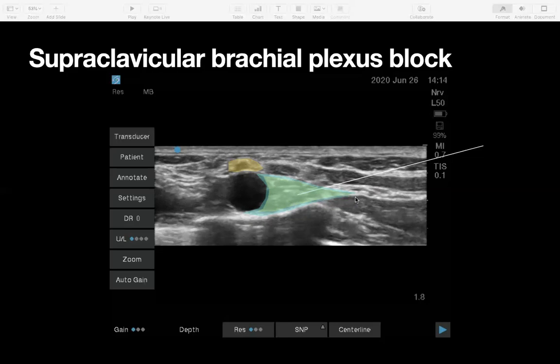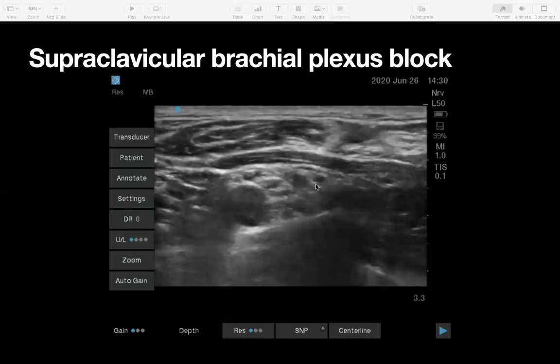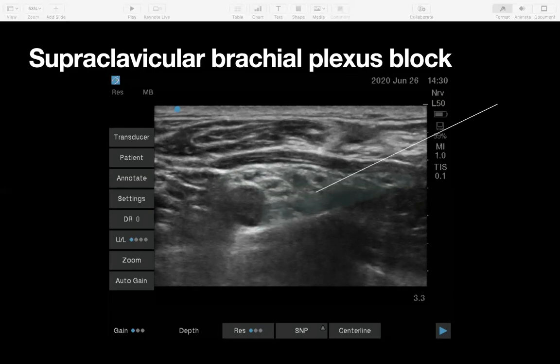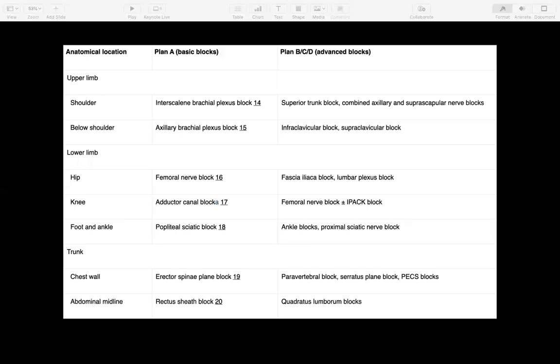Always hydrodissect as you go, ensuring you're never advancing your needle onto nerve tissue itself. You might need to re-angle the needle to get local spreading all the way up. Sometimes it spreads really nicely from one point, but sometimes you need to manoeuvre the needle. To summarise, we've covered the plan A upper limb blocks — the interscalene and axillary brachial plexus blocks — as well as the supraclavicular block.